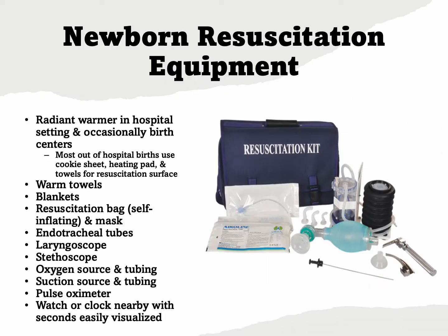Listed here are the required equipment for newborn resuscitation. The newborn is more likely to need resuscitation in certain situations and should be anticipated. For example, newborns are at an increased risk if there was meconium in the fluid, fetal heart rate abnormalities such as decelerations, maternal fever or chorio, maternal diabetes, a prolonged rupture of membranes, cesarean deliveries, and deliveries requiring mechanical assistance.